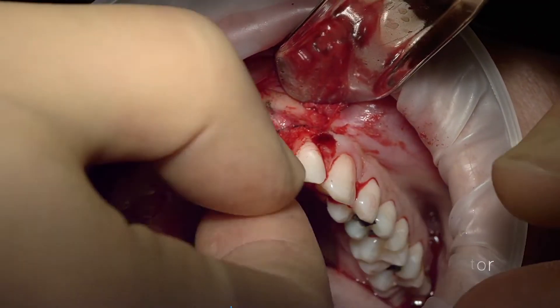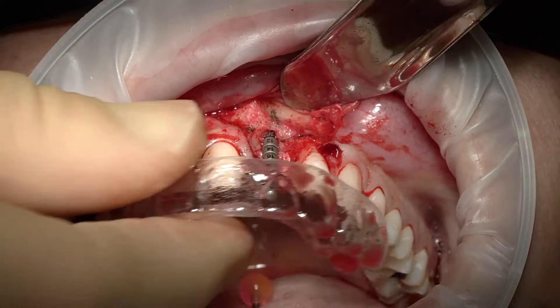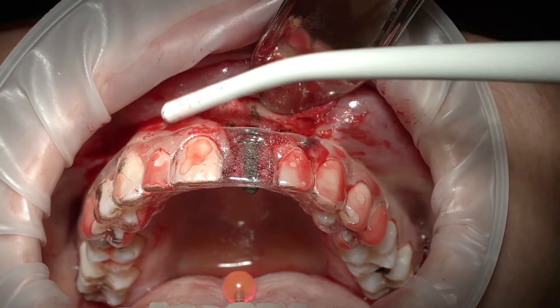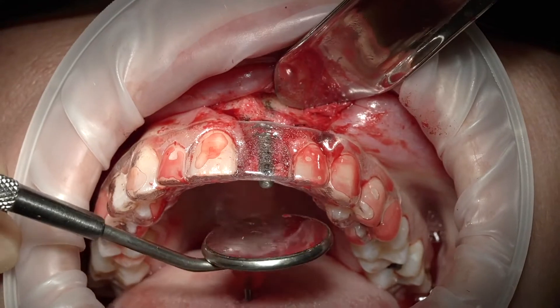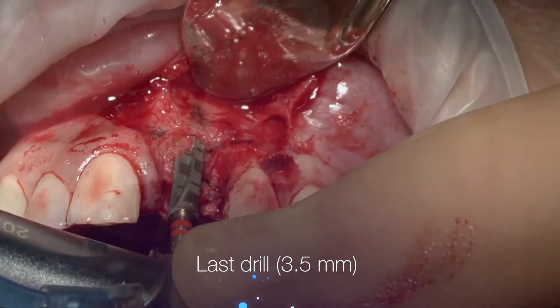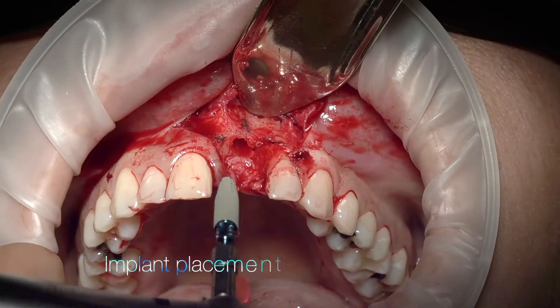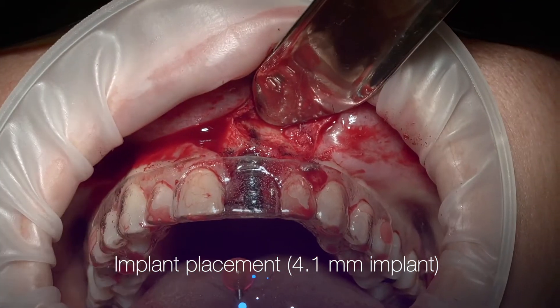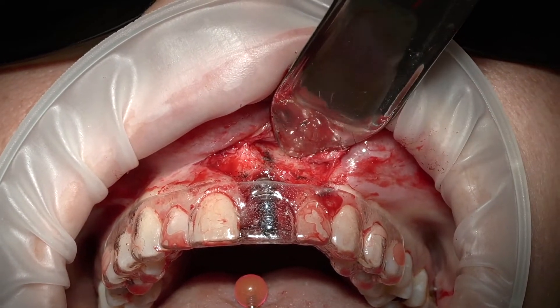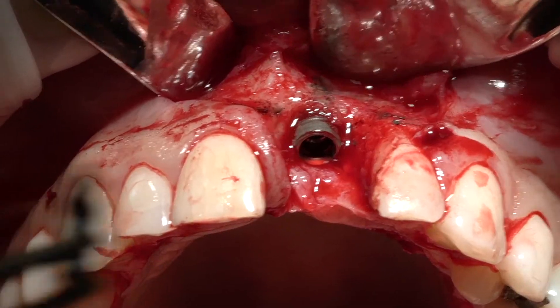Again we put our direction indicator and check the implant position, then check the guide. You can see it's coming out palatally. I'm going to go without water, and you can see how we collected some bone because we drilled at low speed. You can see the implant poking out in the palatal aspect of our central incisor.